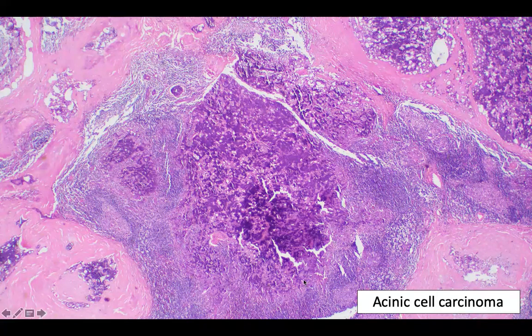So here's an example of a tumor with TALP. So this is a lymphoid proliferation. So this can sort of mimic a lymph node. It's just an unusual pattern. We see it with acinic cell carcinoma very frequently, and also mucoepidermoid carcinoma.